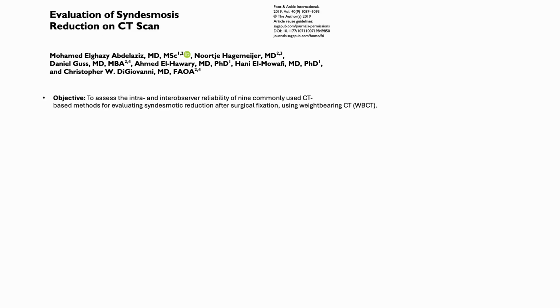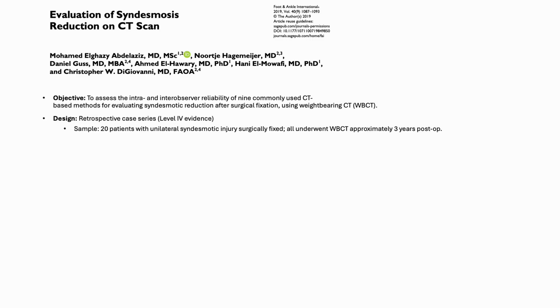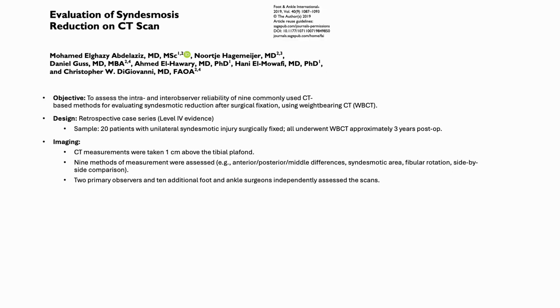So, good studies on this. Evaluation of the syndesmosis reduction on CT scan. Basically, they wanted to test whether a CT scan using weight-bearing methods would be better after surgical fixation. It was a retrospective case study. All patients underwent weight-bearing CT scans about 3 years postoperatively after a unilateral syndesmotic injury that was fixed. They took CT scan measurements about 1 centimeter from the tibial plafond.